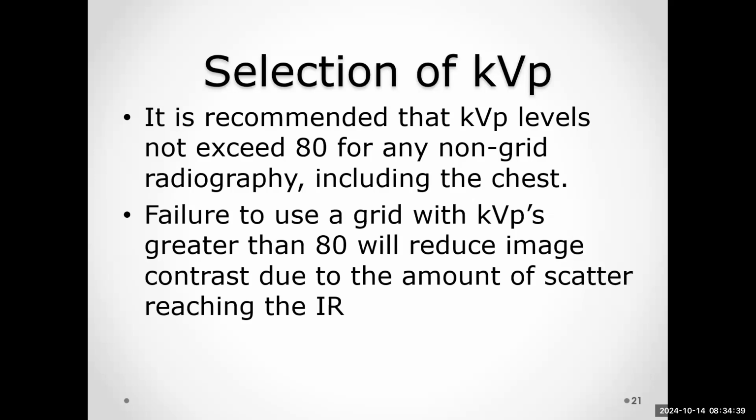So are you going to see this? People do this in clinic, use more than 80 kVp without a grid? Probably. A lot of times they can get by with that now because the software has built-in virtual grids. We'll talk about that next semester when we are really specifically talking about grids and grid use. But in general, it's a good rule of thumb that if you're going to use over 80 kVp, you really should be using a grid.